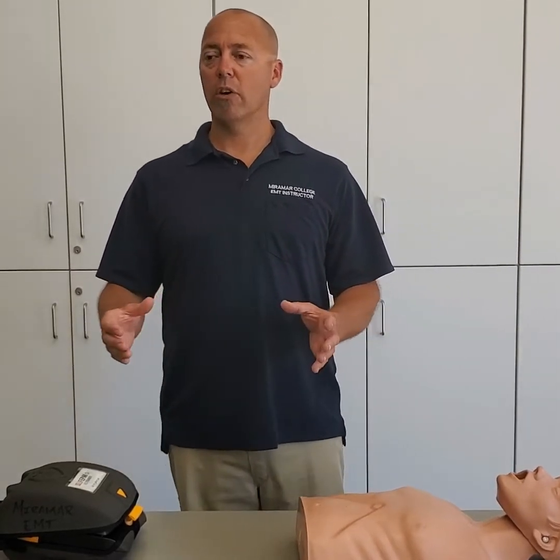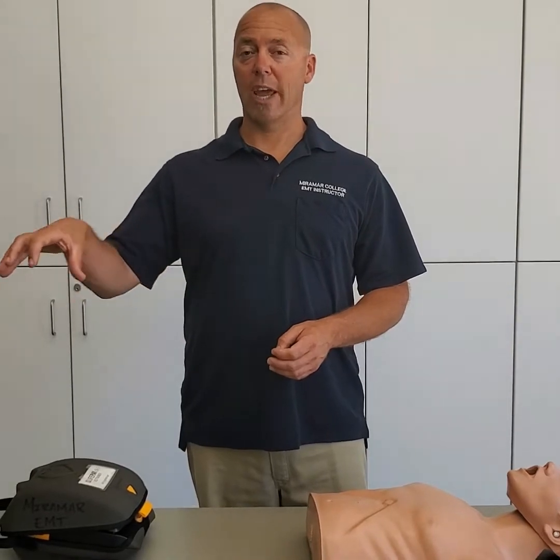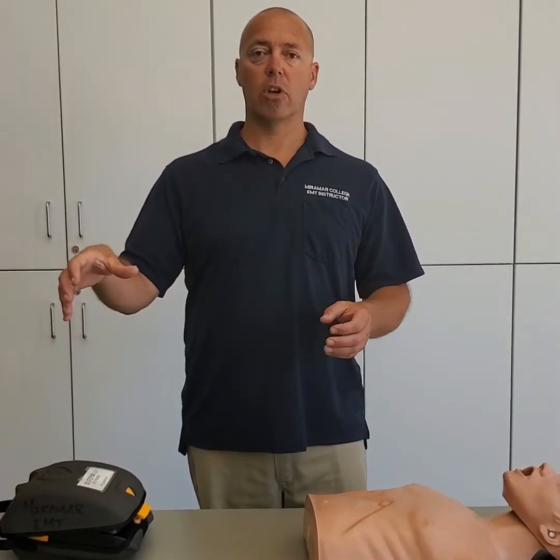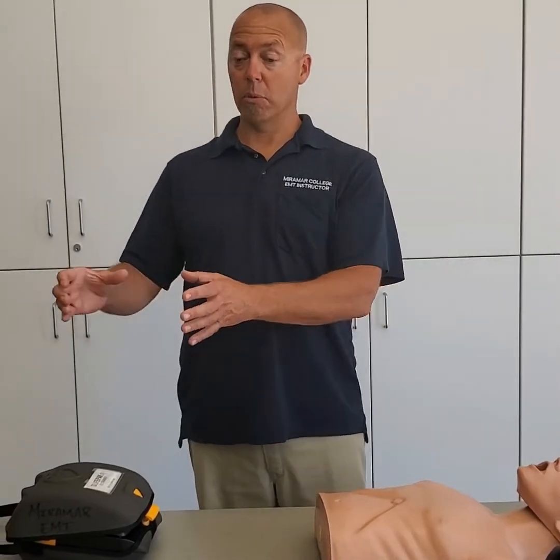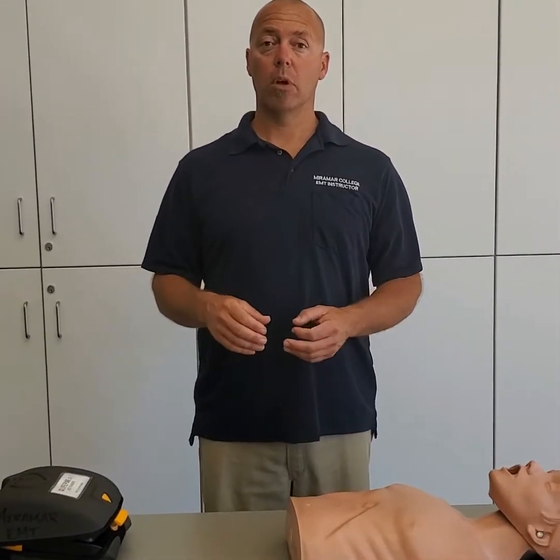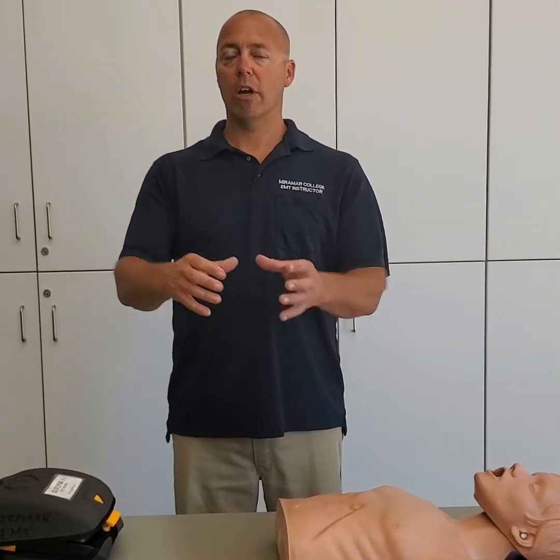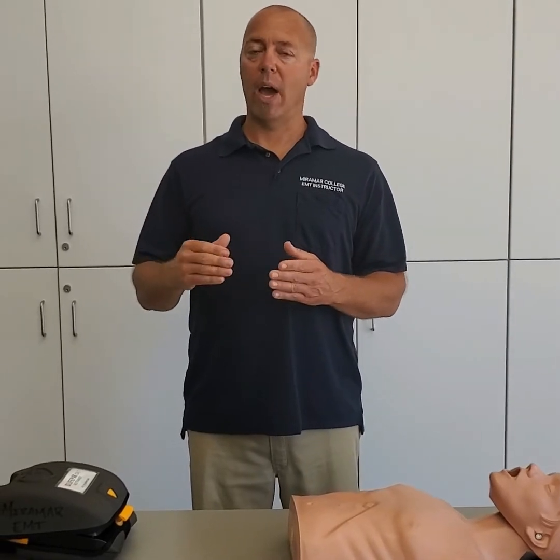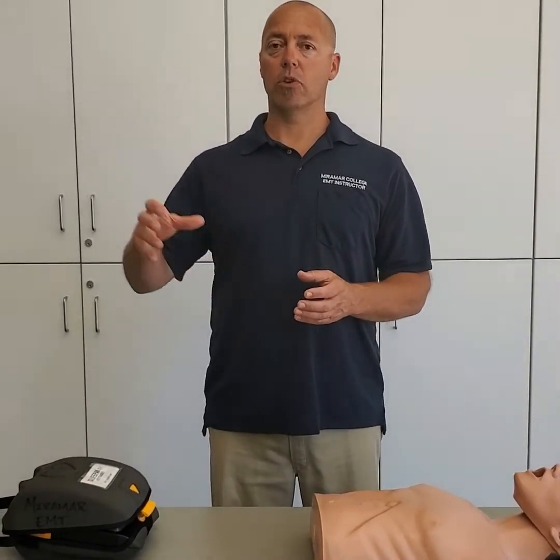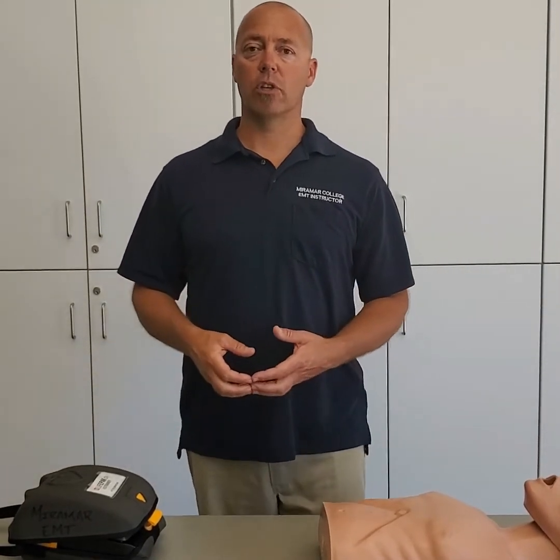I will just tell you that if you don't have the pediatric pads, you actually can use the big pads on an infant or on a child. So you can use the big pads on little people. But the one thing you cannot do is use the little pads on a big person. If you're 8 or greater, you have to use the big pads, because the little pads don't deliver enough electricity to do what they need to do.